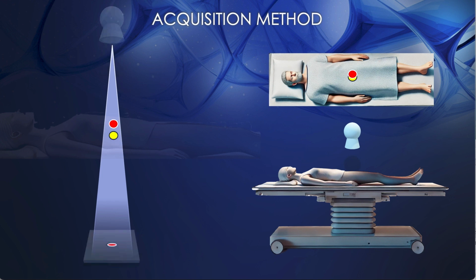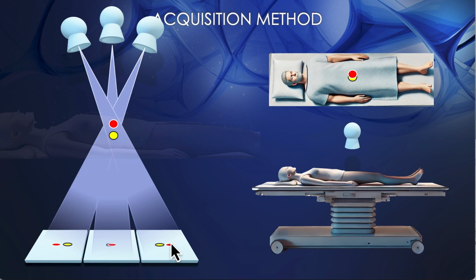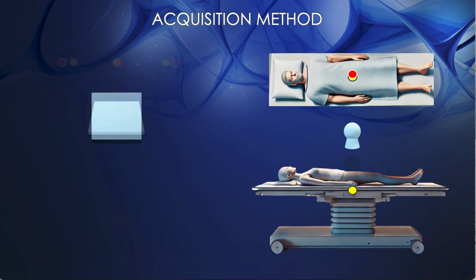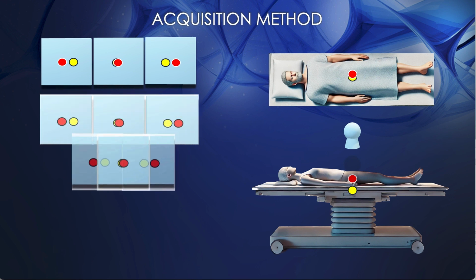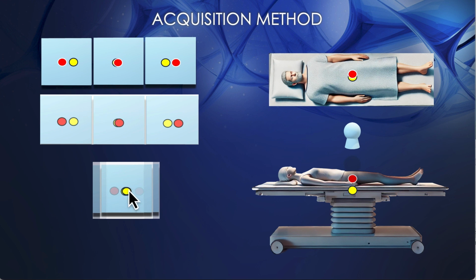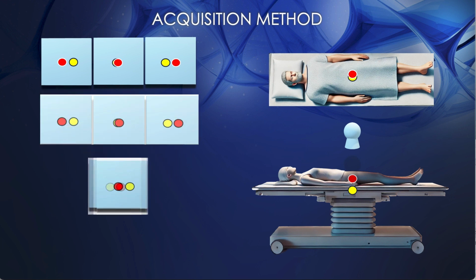But in tomosynthesis, you actually acquire from multiple projections, right? And those projections enable you to separate those two objects because they are present at different depths. And then what happens is, because you have saved those different images that I showed you, you can recombine them and shift them to an appropriate amount where only an object at a particular level superimposes upon itself, whereas objects outside of the level are essentially blurred away because they get reproduced at multiple locations. Right? You can, of course, change the way you combine these so that instead of the yellow in the prior example, you actually have the red that is visible.